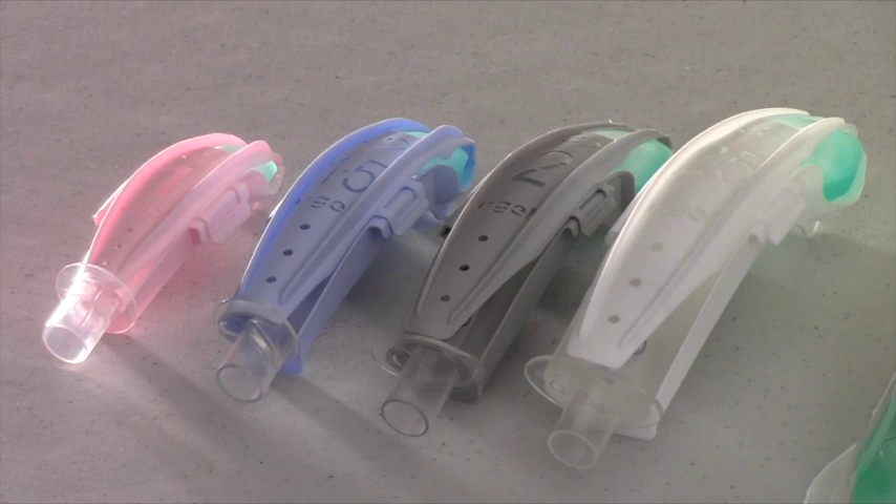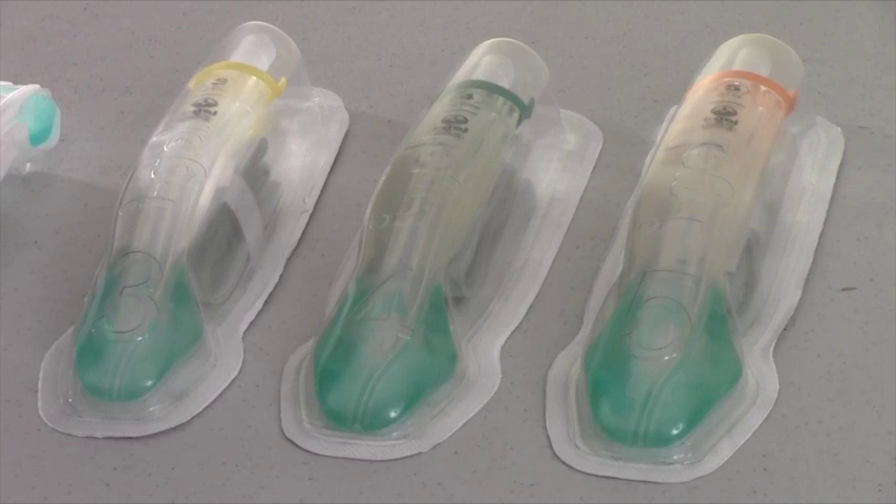One of the reasons for selecting the IGEL is that it comes in multiple sizes — pediatric, child, and adult. The sizes that we will be carrying in our system are sizes 1, 1.5, 2, 2.5, 3, 4, and 5. IGEL sizes 3, 4, and 5 come in what is called a Resus, short for resuscitation, pack. This pack includes the IGEL airway, a package of water-soluble lubricant, the strap needed to secure the airway, the hooks needed to secure the straps, and the supplemental oxygen port. Sizes 3, 4, and 5 are typically used in adult patients.